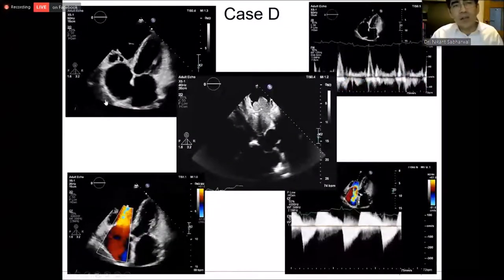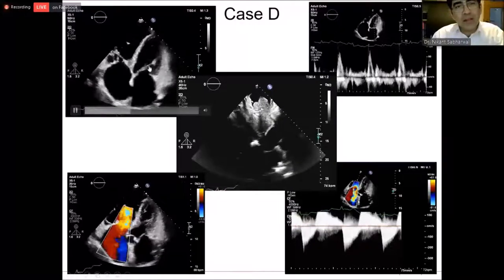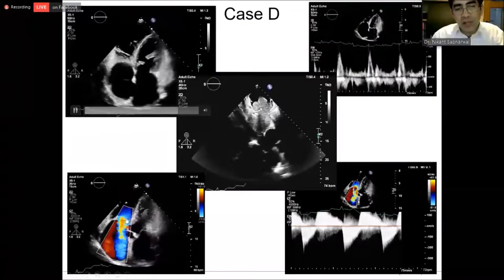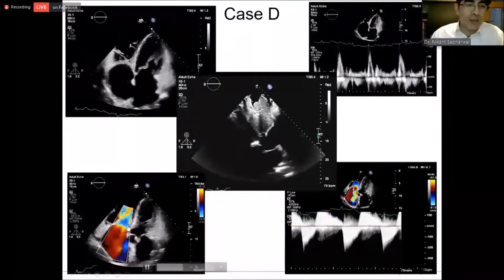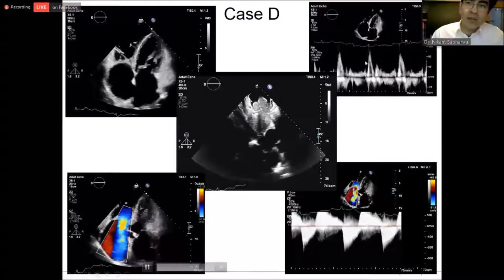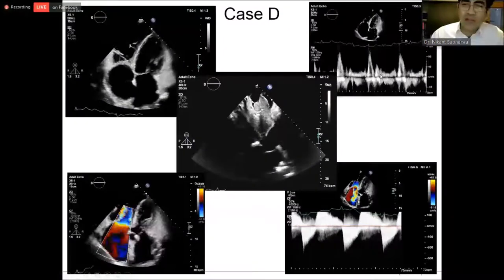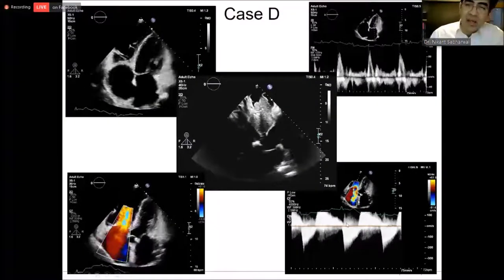When we look at these views here on this modified apical view, the left heart is working very well, big dilated RV, that's straightforward. Again, we get another view of this torrential free flow TR and some TS as well. Her mitral inflow isn't too bad. This lady's in her late 60s, early 70s, so for the UK, that's pretty good. And then we see the TR.